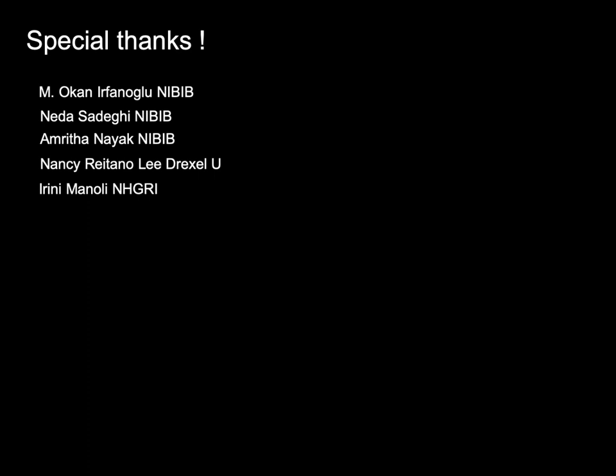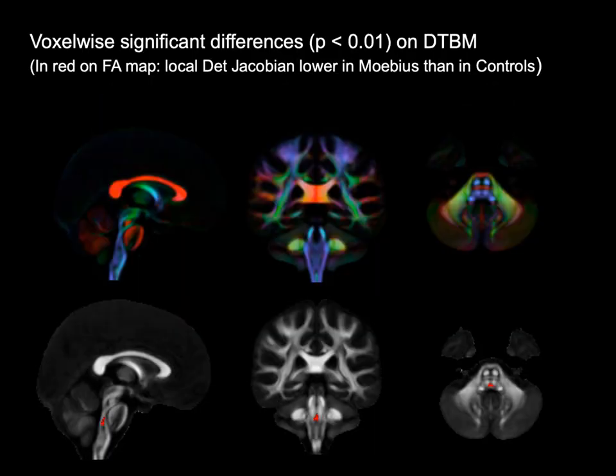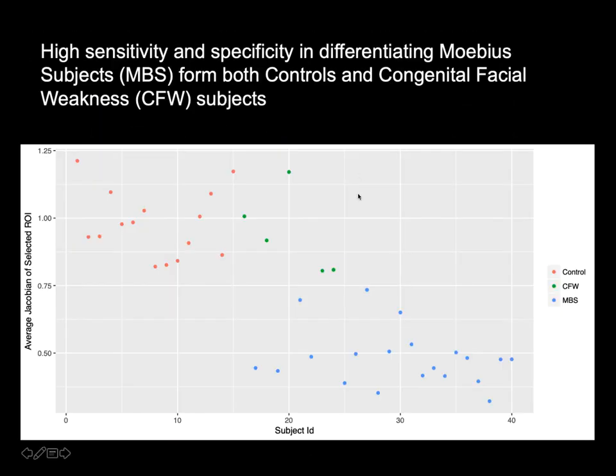With your Mobius data, it looked like you were plotting the Jacobian on the y-axis. So were they less variable than healthy controls? I think the variability was similar. The data was normalized. Okay, the data I think is here. So you say here, now I have a difficulty seeing the colors here. So this is the variabilities from 0.5 down to 0.25, right?